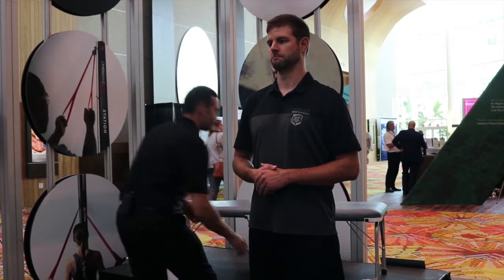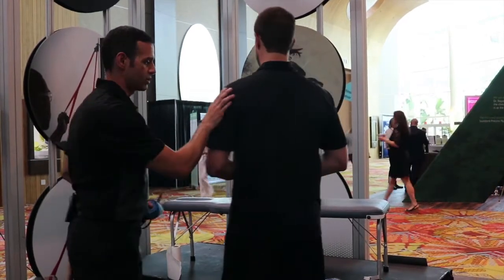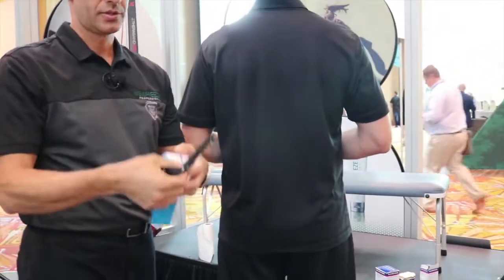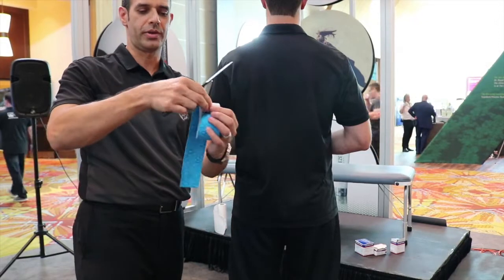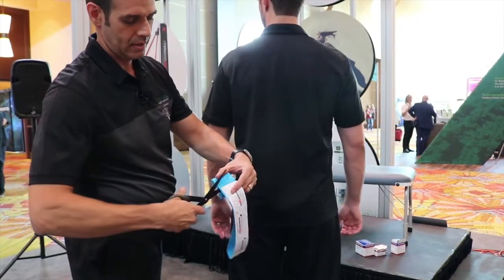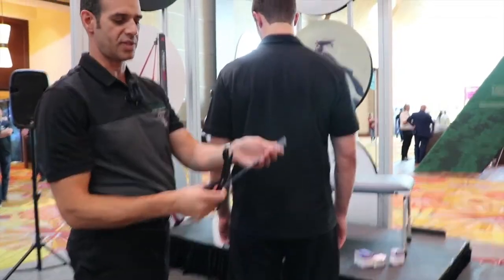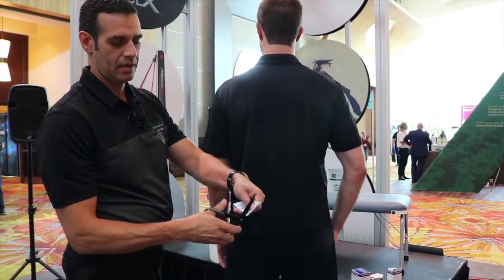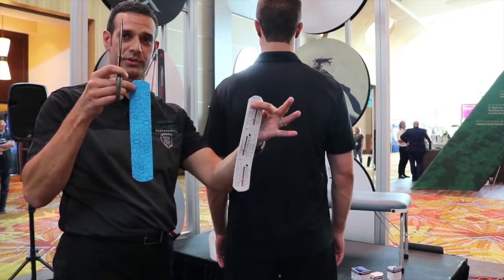So the tape job for that is relatively simple. All we're going to do is have the patient turn. I'm going to measure this over his clothing. So what I've done here is I've measured one side of the back, but we're going to do both. And all I'm going to do is fold that tape in half, make one cut to have the two same size, and then since this is obviously for a clinical purpose, we can fold the tape in half again and round our edges. And now we have two individual cuts.